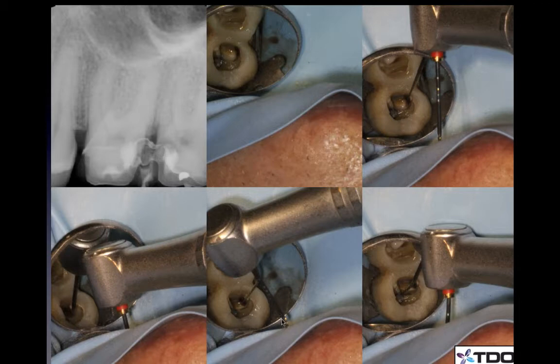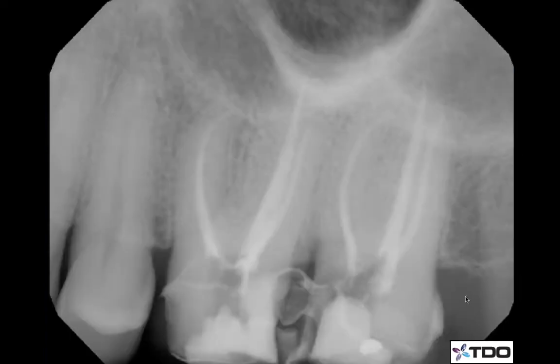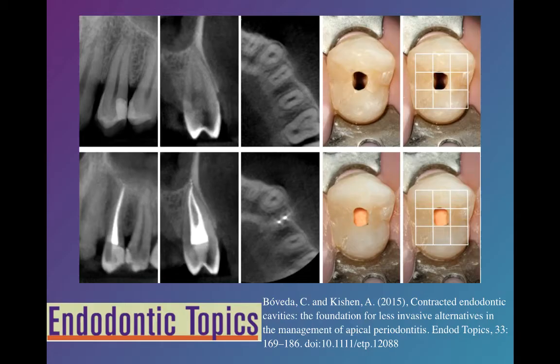You can see this one coming down, starting to torque toward the buccal. And here on the mirror, you can see it torquing and heading into that distal buccal canal that we would not have been able to get to. We're using this advantage of the newer instruments to snake into areas we wouldn't have been able to reach before. This is how that patient left, with all of this dentin here preserved — and I think that's important.